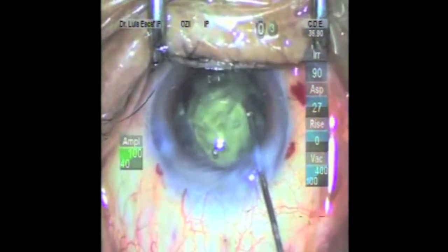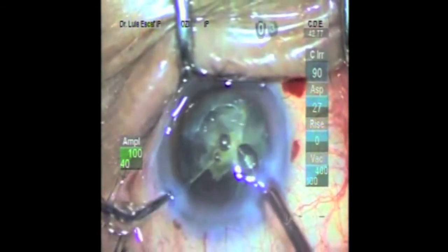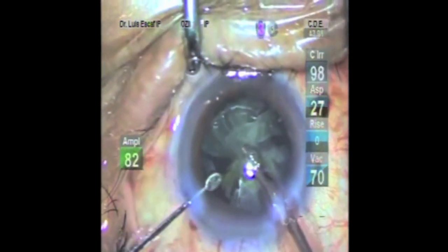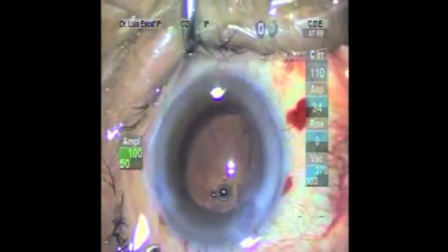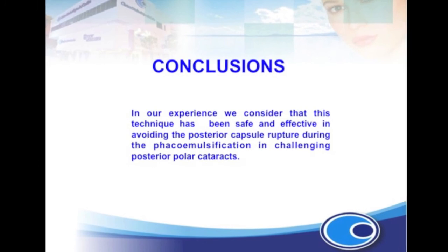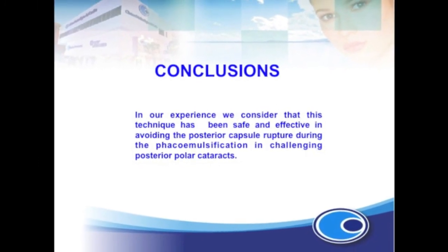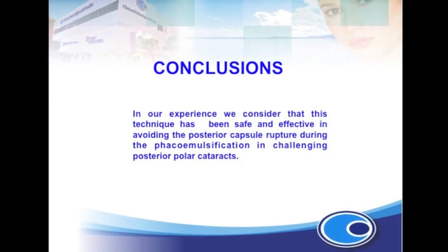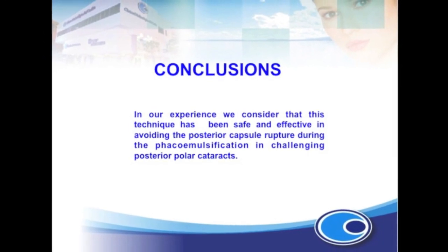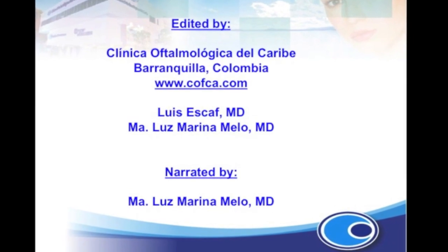We introduce dispersive viscoelastic to gently detach the posterior plate. The procedure is completed using the Akahoshi phacoemulsification tip. We can see the imprint and the posterior capsule remains intact. We believe this approach to the posterior polar cataract is a logical strategy — effective, safe, easy, and a reproducible method for handling these cases.